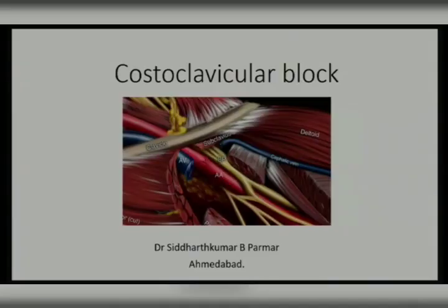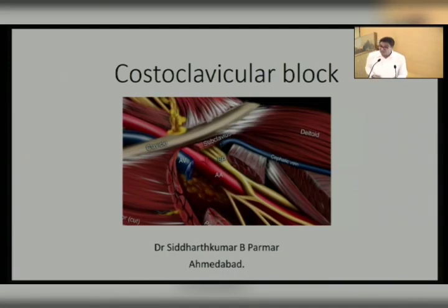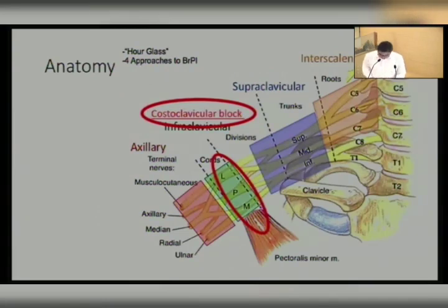Second. So this is a below clavicle block. And costoclavicular block is a newer block, and that space is actually in between the clavicle and rib. Okay. And the main important target over here is the lateral, posterior and medial cord, and it is the most proximal approach of infraclavicular block.